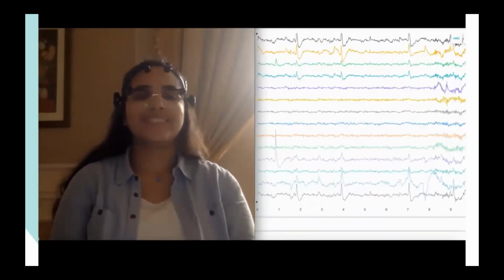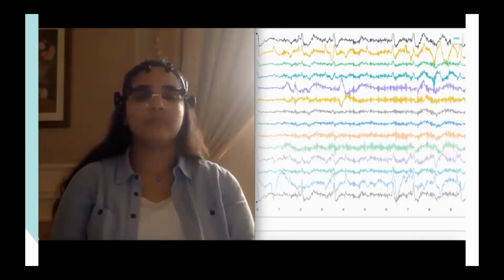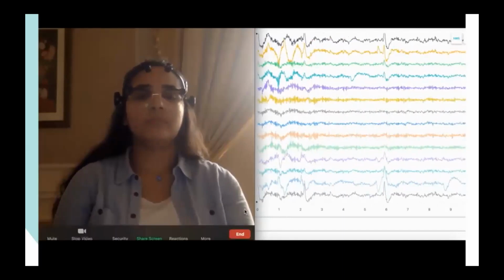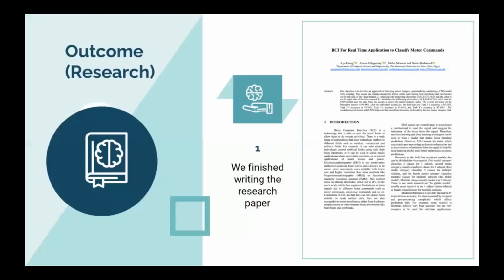And now I started smiling, and that appears in the EEG signal also. Now back to rest. And now the peaks that appear in the EEG signal even after I stopped moving or smiling are a result of me blinking.